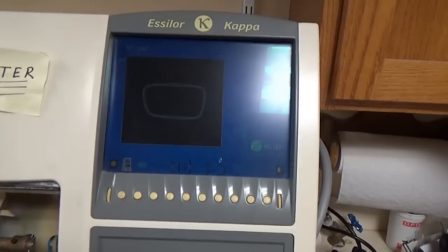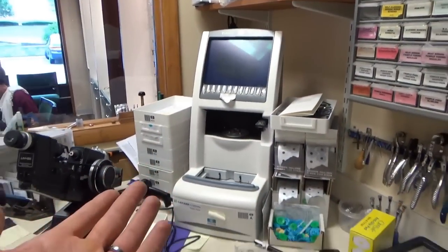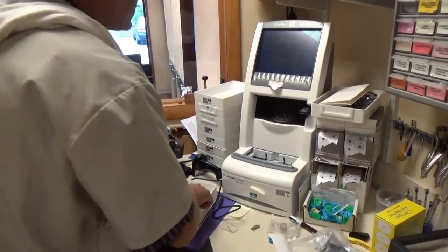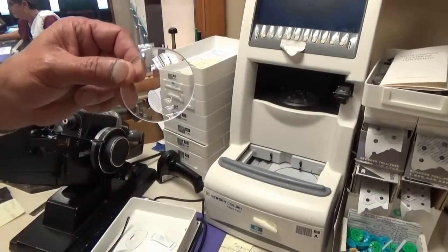Here we have the edger installed — water lines hooked up, power's hooked up. It's hooked up to the control station, the tracer. We're going to go through the whole process of making a bifocal with a line — what's called a bifocal with a line.